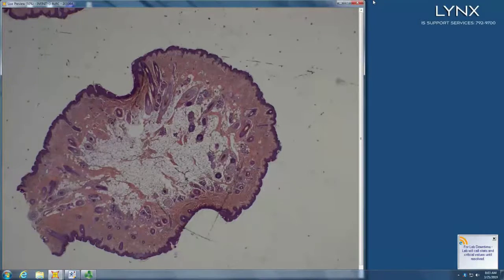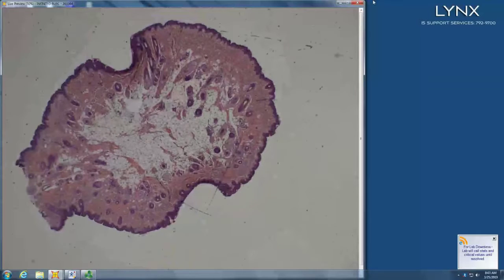And there's a lot of little hairs. Yeah, lots of little hairs. Like what part of the body? Like the face? I'm not sure. Yeah, like lid or ear has lots and lots of little hairs like that. And this is kind of a bump. Wondering if it's an accessory tragus. That's exactly what it is, an accessory tragus. No cartilage, but accessory tragus, because it looks like ear skin.